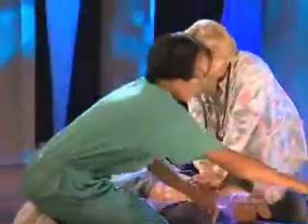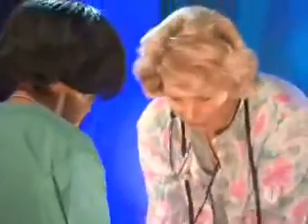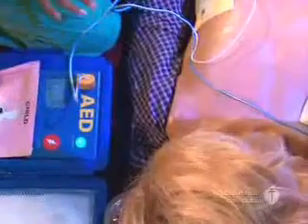Then return to the victim to provide CPR and defibrillation as needed. When the AED arrives, put it near the rescuer who will be operating the AED and turn it on. Some AEDs turn on when you lift the cover; others have a power button. Apply pads to the patient's bare chest. Open the AED pad package, peel off the plastic backing, and press the sticky side on the victim's bare chest. Place one pad on the upper right side of the bare chest to the right of the breastbone, and put the other pad a few inches below the left armpit. With two rescuers, don't stop CPR until the AED pads are attached to the chest and you are ready to let the AED analyze the victim's heart rhythm. Plug in the pads connector next to the flashing light.